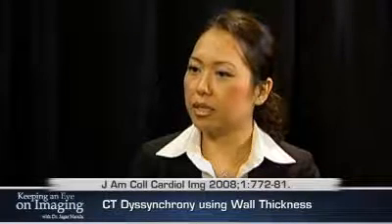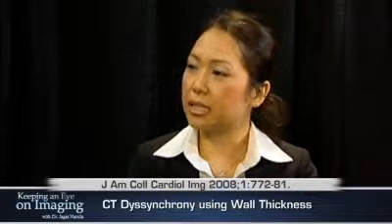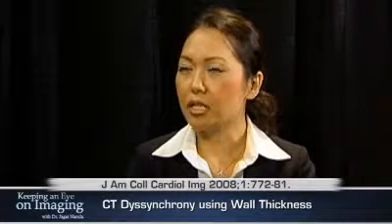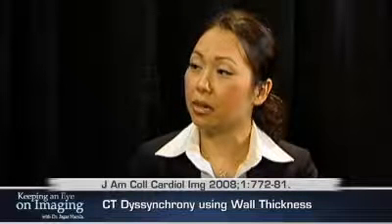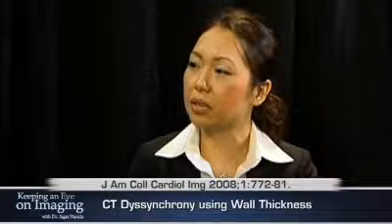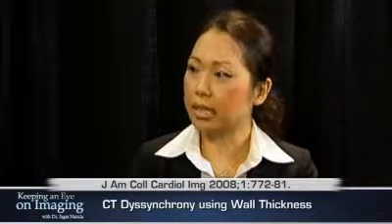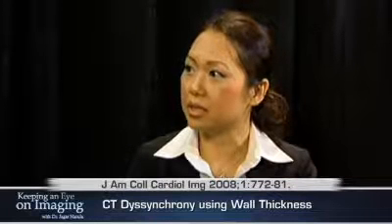Correct. This is a proof of principle and proof of concept study, and the CT scanner that was used in this study was the 64-slice CT scanner, and the temporal resolution from that scanner was quite limited. But what's amazing about it is that despite the limited temporal resolution, we were still able to discern a significant difference between patients most likely with dyssynchrony and patients who are normal control without dyssynchrony. So with the newer CT scanners with better temporal resolution, I think there's great potential for CT to be able to assess dyssynchrony.